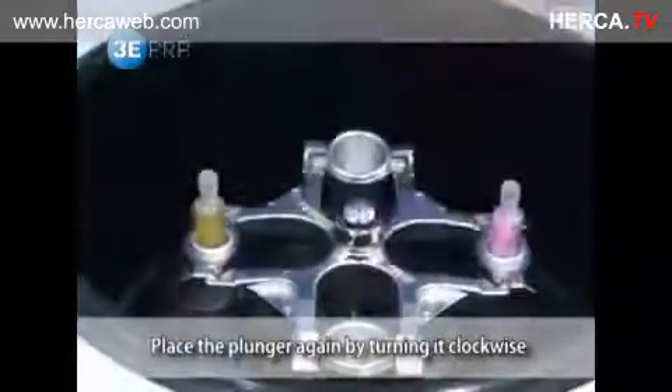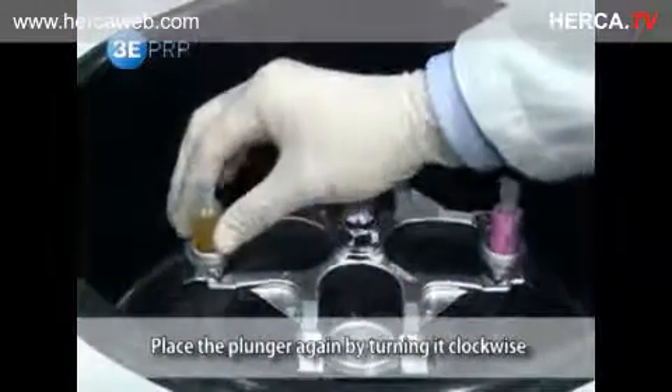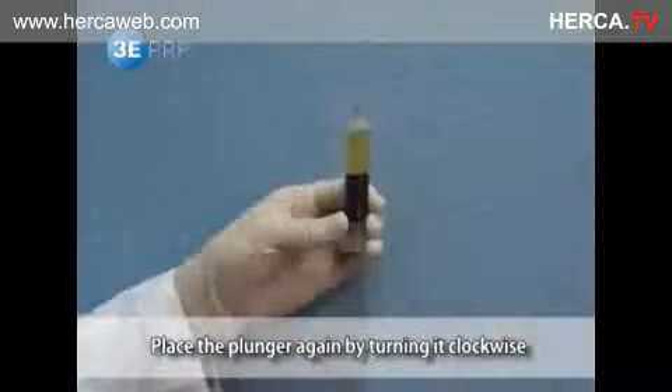Take out the kit carefully from the centrifuge without agitating it, and place the plunger again by turning it clockwise.